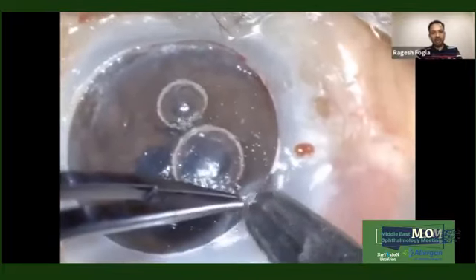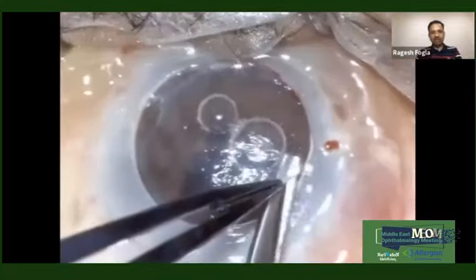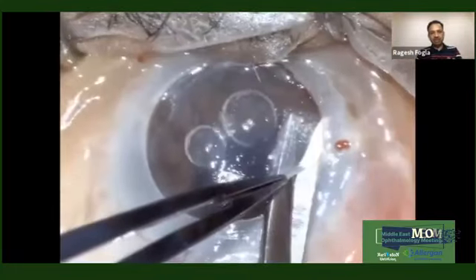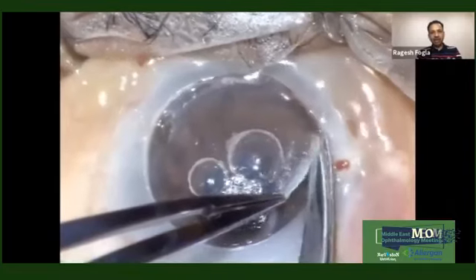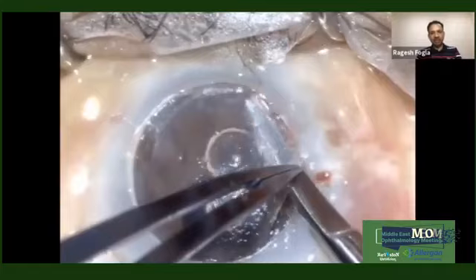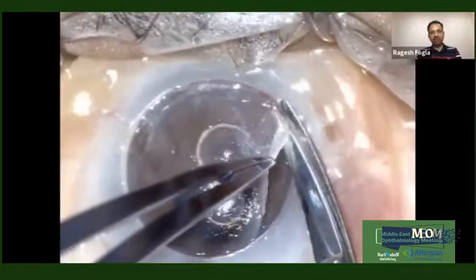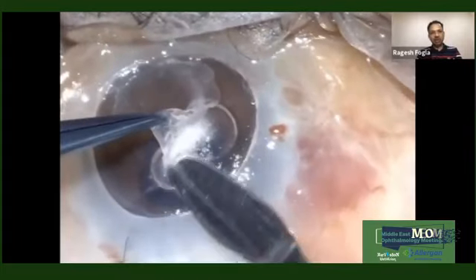Then we went back to the cornea and we created a further deeper plane of dissection, at about maybe 90% depth. And we made this groove in the periphery using a pair of blunt-tipped fine scissors. Now I use a specific instrument that I've designed, which is available from stores. It's called the stromal pocket forceps.